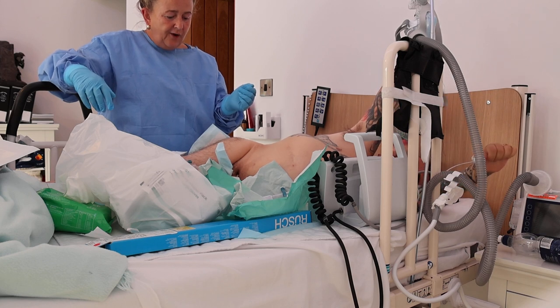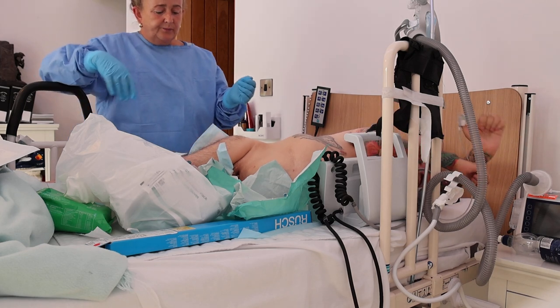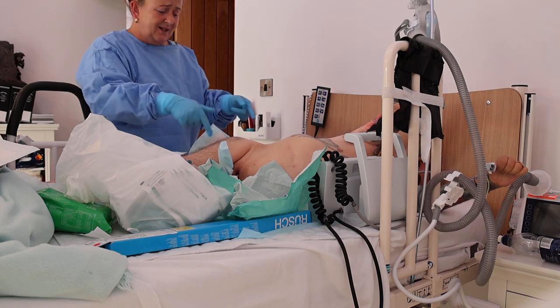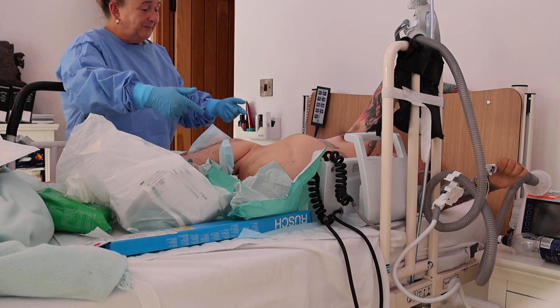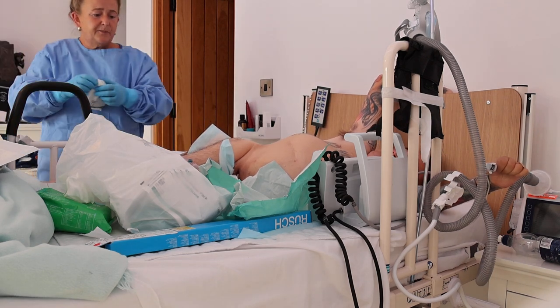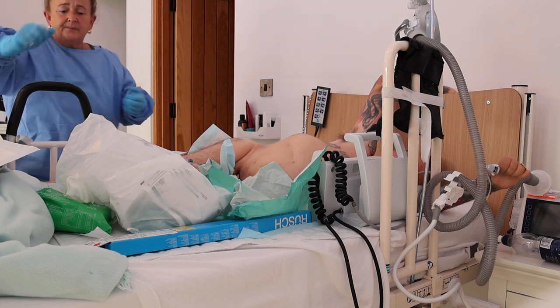On the catheter change itself, the other day I did not have any issues popping it back in. It was obviously the channel, it went in perfect. It's just that today there's an issue downstairs, and we're going out, and he doesn't want to be double incontinent, and this is the only way forward. Otherwise, we'd have to stay in, wouldn't we? And no, we're not staying in. So this is why I'm doing it. I'll just get on my sterilised gloves. I'll get another catheter pack ready on my trolley, because it's better there. I've sterilised the whole trolley down.